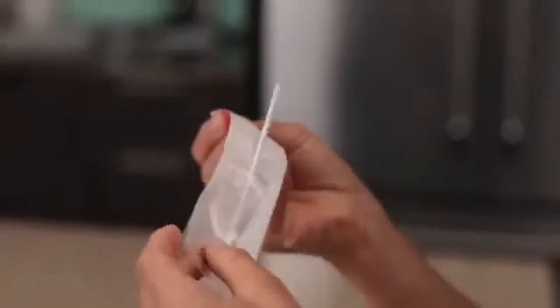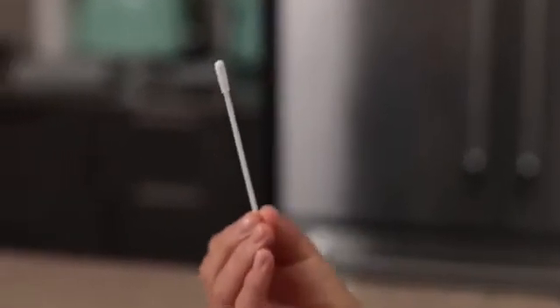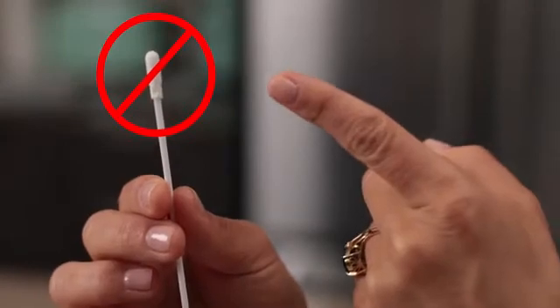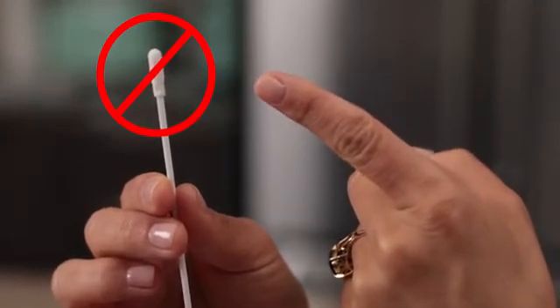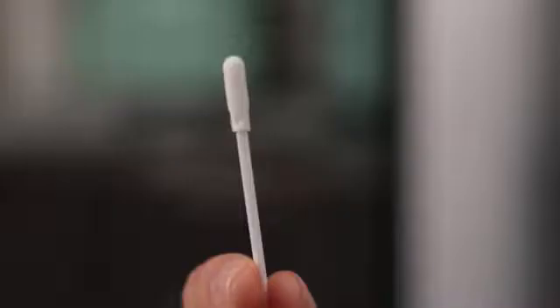Open the handle end of the swab package and pull out the swab. Be sure not to touch the swab end with your fingers or bring the swab into contact with any potentially germy surfaces, other than the ones on the inside of your nostrils, of course. Which brings us to the fun part we know you've been looking forward to. Yes, this thing's going inside of your nose.